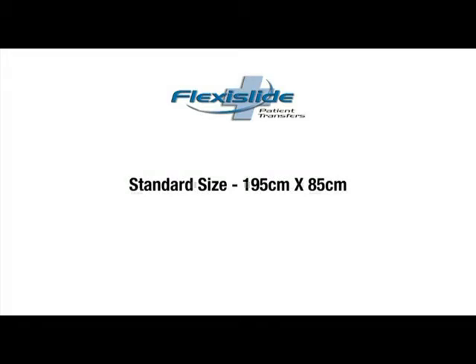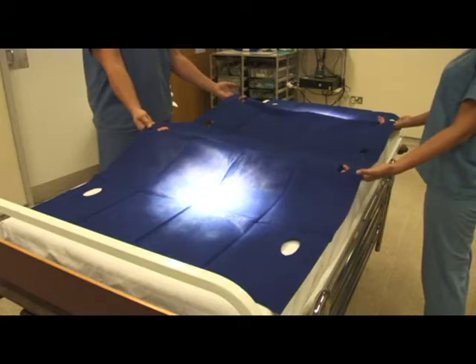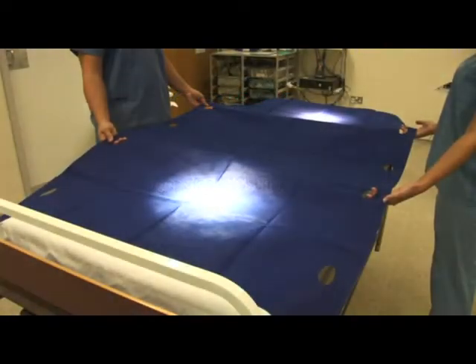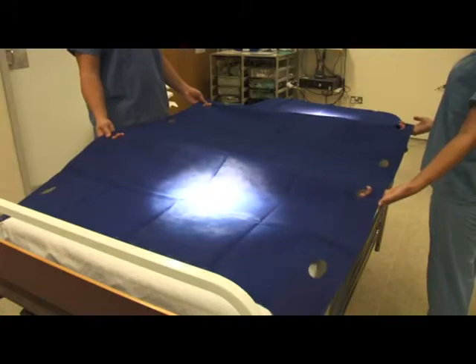The standard size is 195cm long and 85cm wide, making it the perfect length for trolleys and operating tables. The standard size is both long and wide enough for the majority of patients. FlexiSlide is also available in a larger size that is 115cm wide, suitable for bariatric patients and also ideal for use by maternity and orthopaedic departments. This extra wide product also becomes useful when any of the transfers involve the patient's bed.